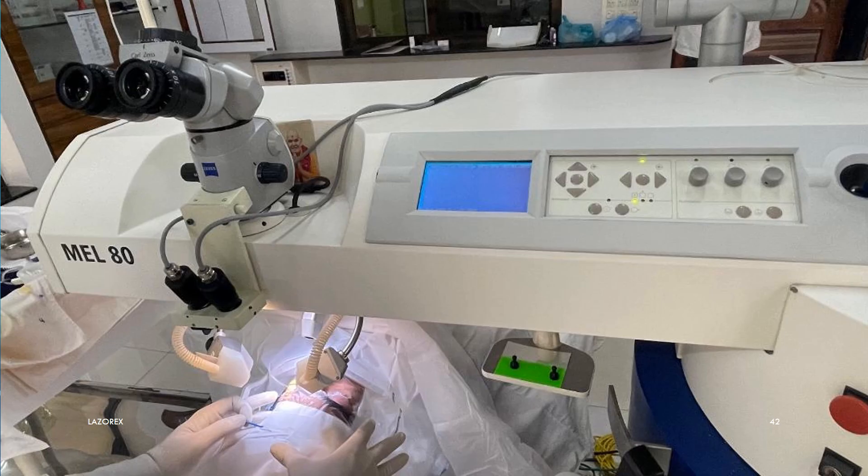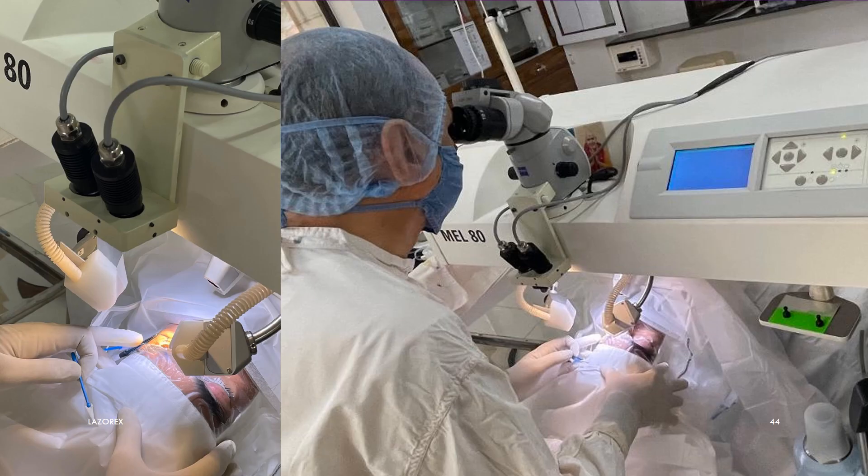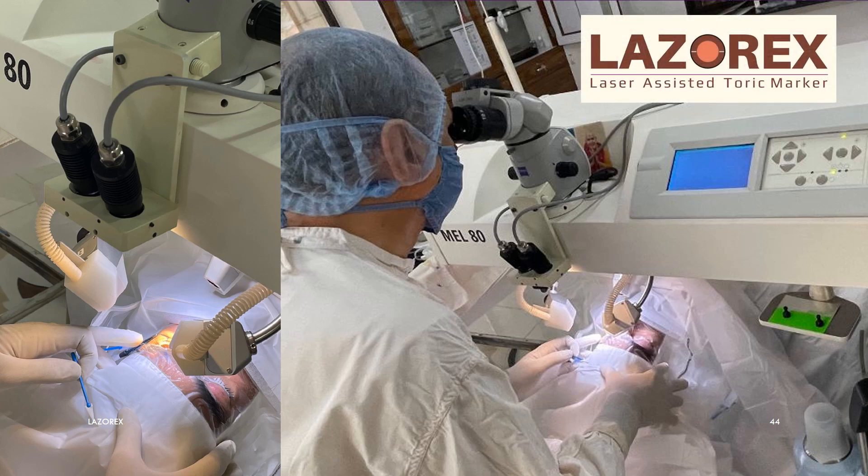My excimer laser does not have automated cyclotorsion error detection and correction, so employing the zero-line function, I use LaserX markings for this purpose to find the plus or minus axis shift manually. Thus, LaserX is useful not only for cataract surgeries, but also for ICLs and laser vision correction surgeries. Thank you very much for your kind attention.